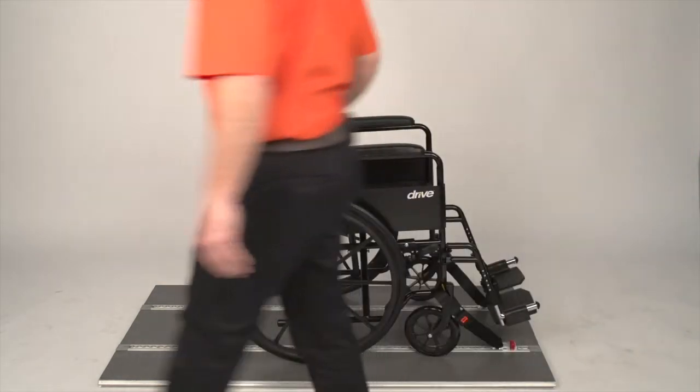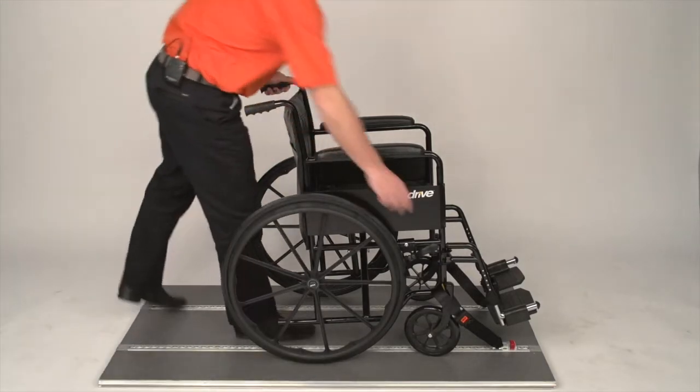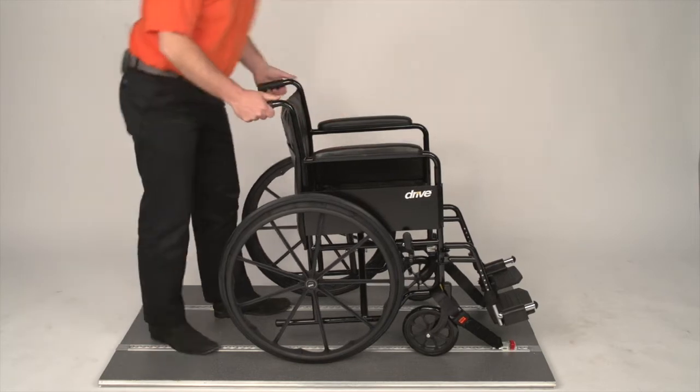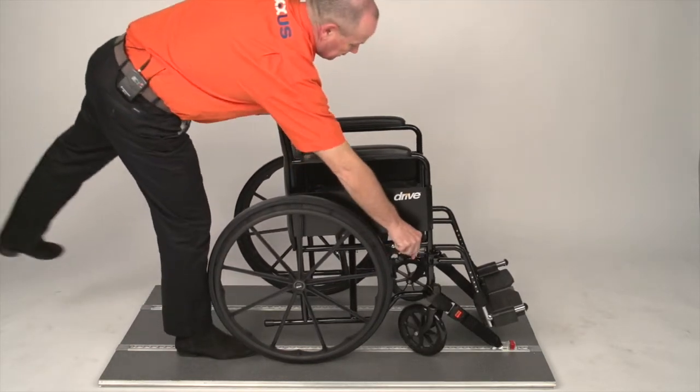The front straps are non-adjustable, so we have to put tension on. We come to the rear of the wheelchair, release the brakes, pull the wheelchair back towards you, then put the brakes back on.